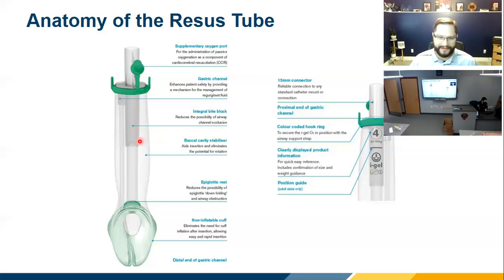The good news is it's big enough that if you were to lose something, it's going to go esophageal, not covering the trachea. The other thing you'll notice is that this tube is actually oval in shape. The reason for that is there are times when an airway device can rotate laterally inside the airway. I've been doing this about 20 years and never had that happen, but apparently it occurs enough that they made an engineering control to solve it.